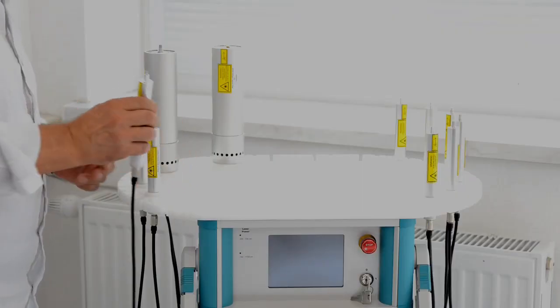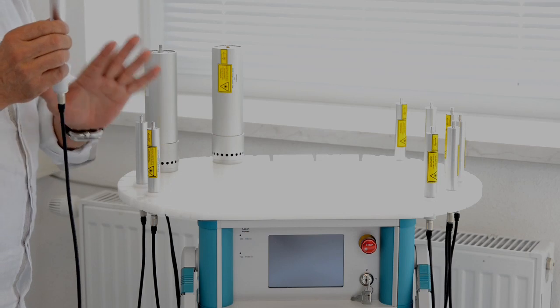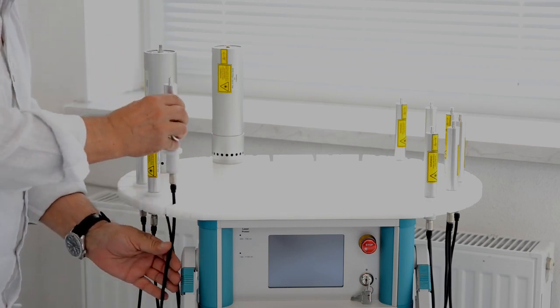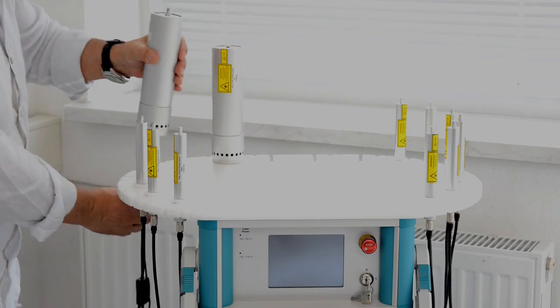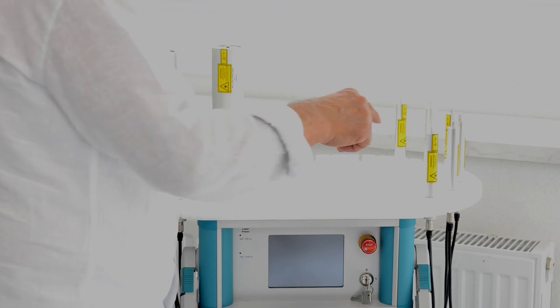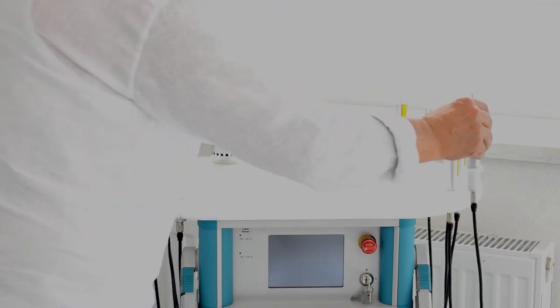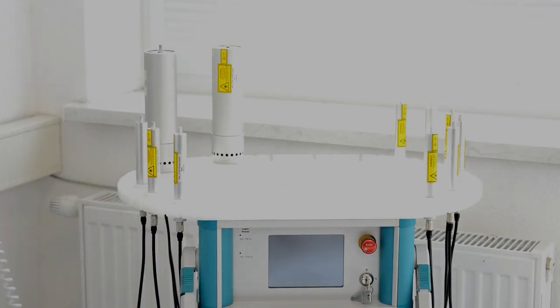So now you can see that we put in the intravenous laser with low power, only 5 milliwatt, on the left side in the holder plate, and the stronger 100 milliwatt infrared lasers on the right side of the device.